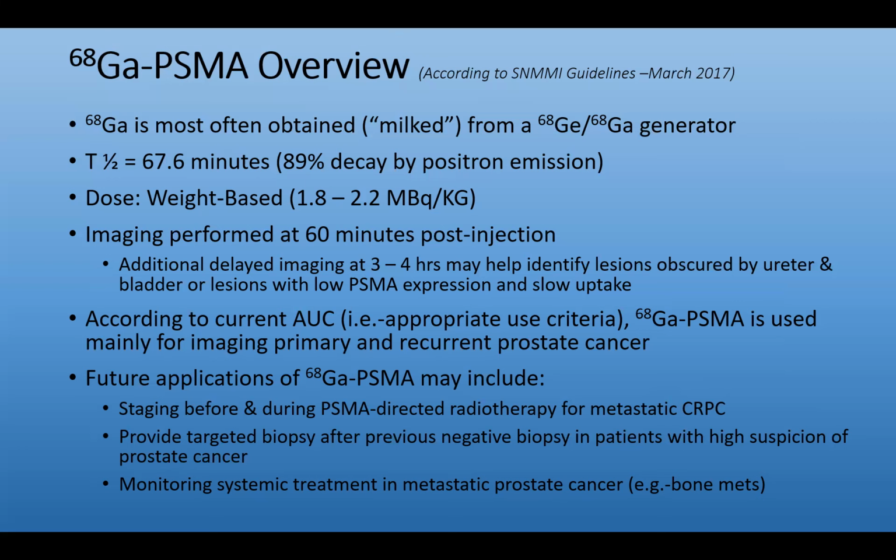So it's got a relatively short half-life, shorter than FDG. This may be a little bit problematic, obviously, because that means we have to scan them fairly early on. We routinely would scan at about 1 hour. You can probably do up to 3 to 4 hour delays, but be aware that they may be count poor because of the significant radioactive decay.